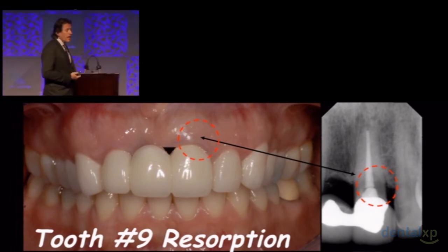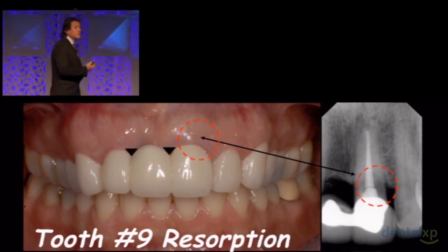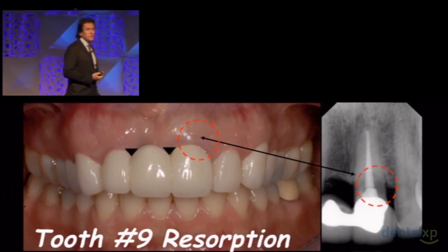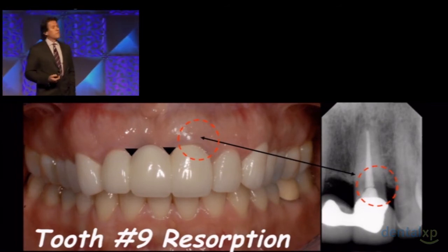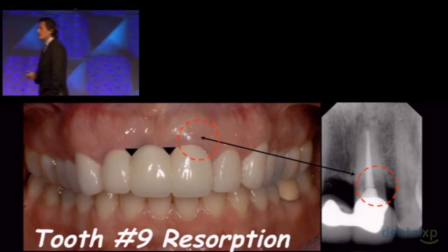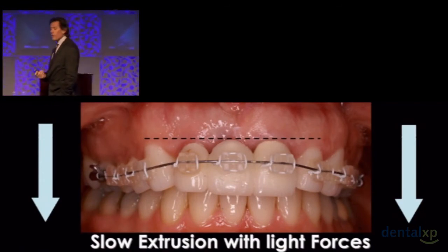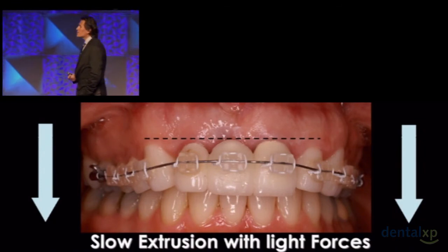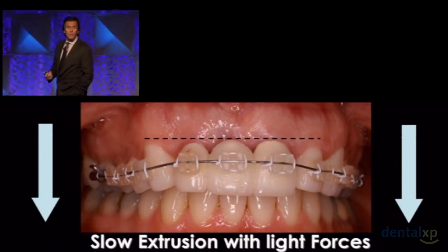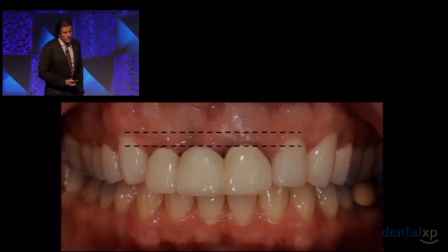And if we look at this case, look at where the papillas are now before we start. You have very long teeth and very long contact points. I know that I'm already dealing with not only a buccolingual and extraction site maintenance case, but a vertical type 3 ridge defect. So what I'm going to do first is to use what's been around for a long time. I'm going to turn a type 3 case into a type 2 case by just putting some braces on and slowly erupting the entire bridge. Not just one tooth, but 3 teeth.